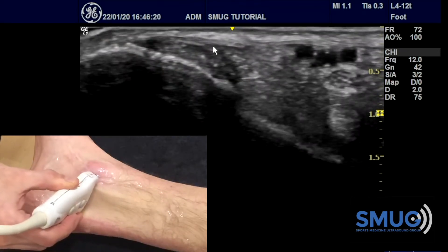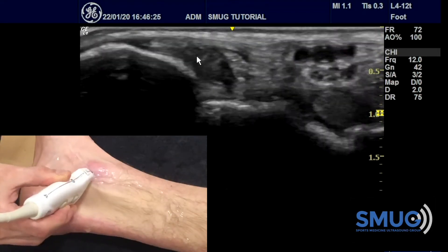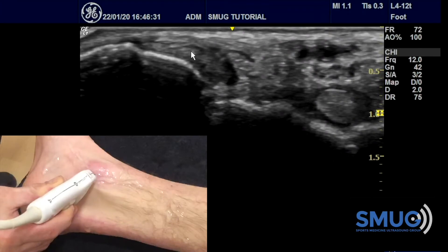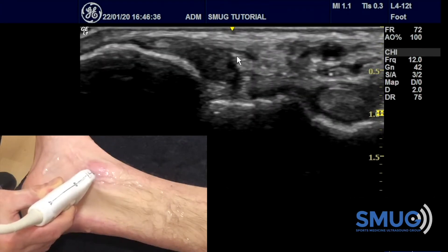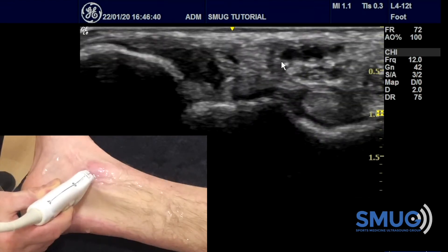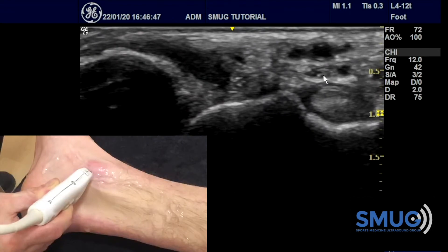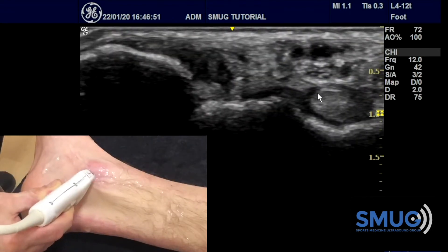You then angle the posterior side of your probe a little bit towards the heel, and if you do that correctly and slowly, you should be able to identify all the structures. The first is the tibialis posterior that we already saw. Next to it is a very small rounded tendon — the flexor digitorum longus. Further posteriorly you see the arteries and veins — you can let them compress the veins, there you go, I'm pushing it down — with the tibial nerve underneath.